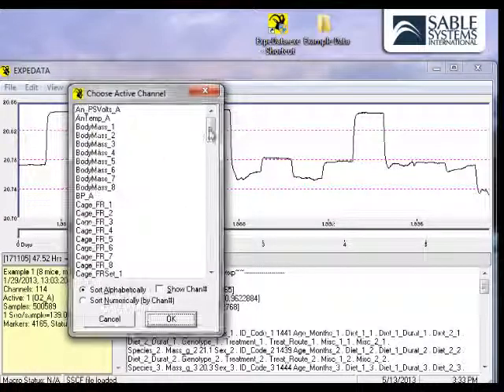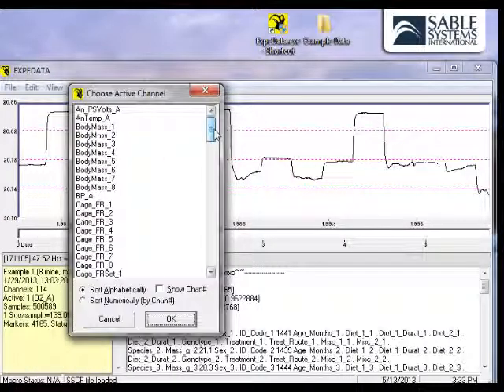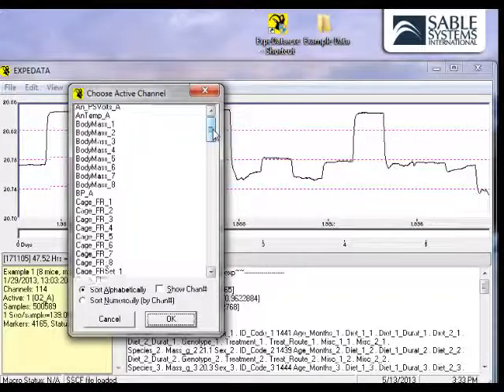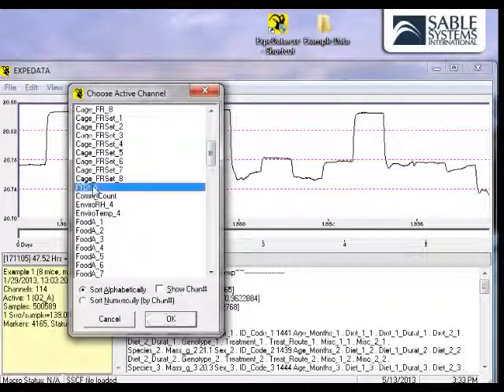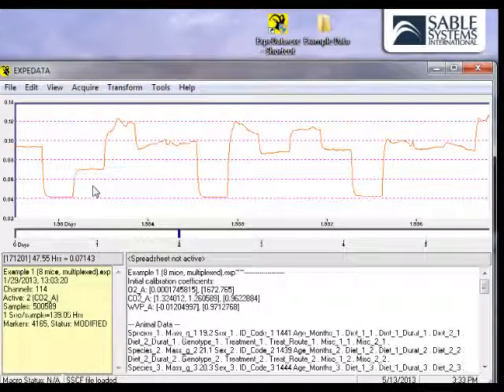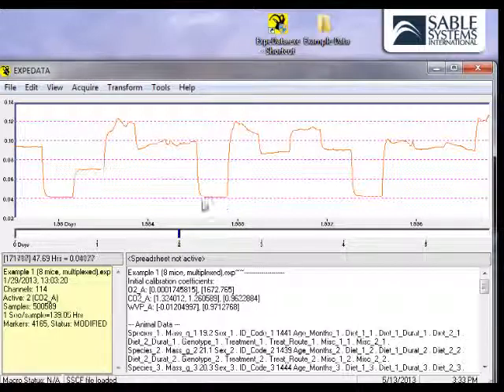The menu of channel options will then come into view, and let's choose the output of the CO2 analyzer. Here you can see it's a nice inverse of the data from the oxygen analyzer.